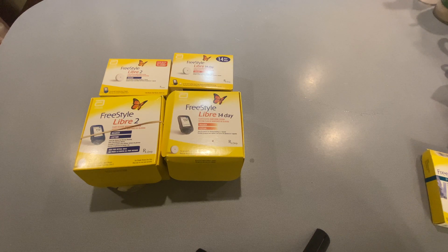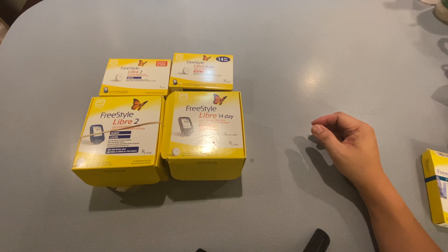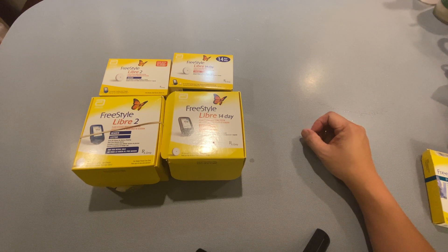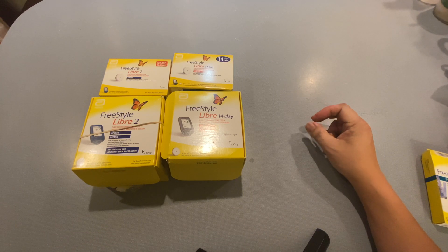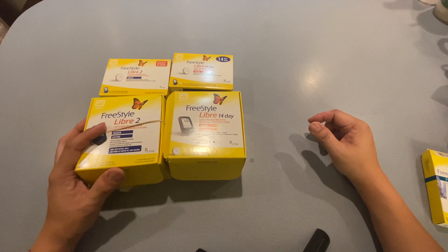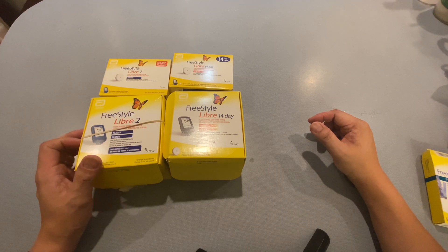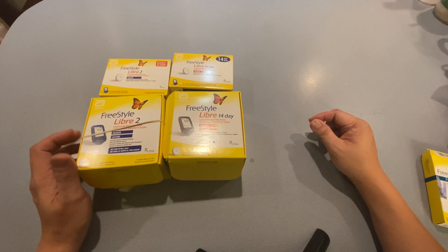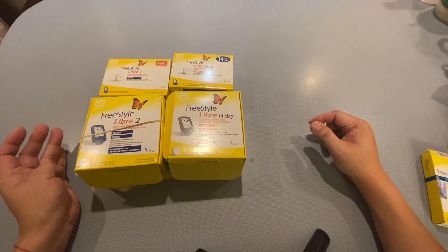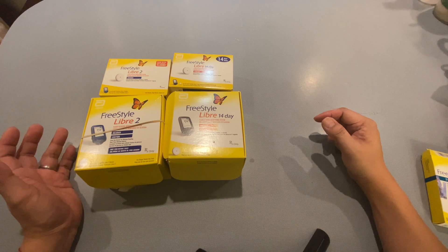I have in front of me the Freestyle Libre 14-day system, which is the Generation 1 — the first one that they released. This is released by Abbott Laboratories and is available pretty much worldwide. The newer system they recently released is the Freestyle Libre 2, and I do have both of them. I wanted to go over some pros and cons of both systems, because newer isn't always better. We'll do the unboxing of both units.